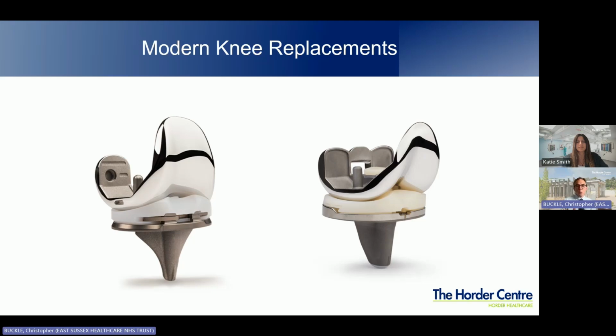So you've got really important ones down the side of your knee. They're called your collaterals. They're essentially guy ropes that run down the inside and the outside of your knee, and they are absolutely vital to be maintained with any sort of a knee replacement. They are the key things that we work to retension, to rebalance the knee, to take it back to its normal alignment so those pair of ligaments function normally. So yes, cruciate ligaments do get resected, either in their entirety or in part, but that function is replaced by the implant, but the other ones are much more important.